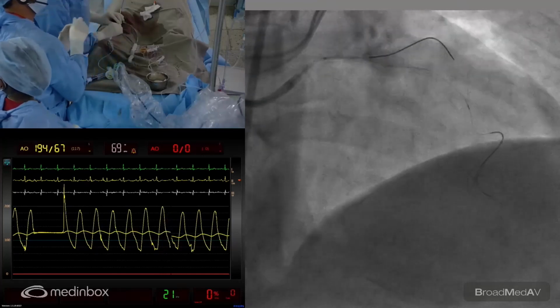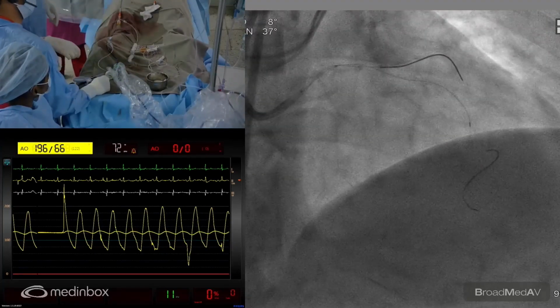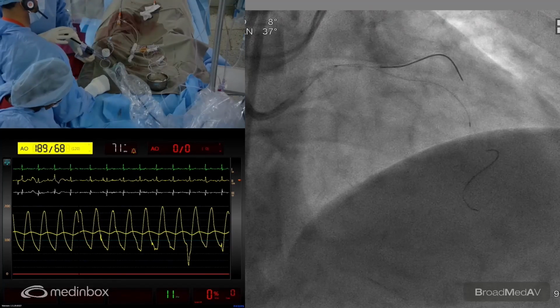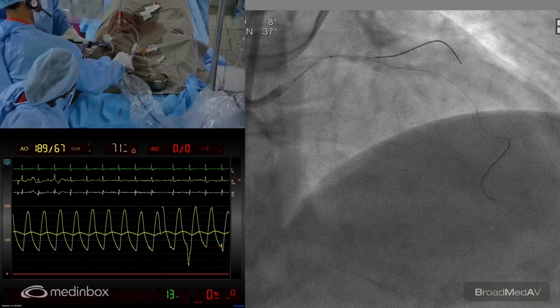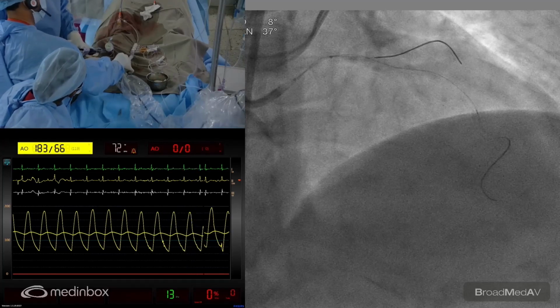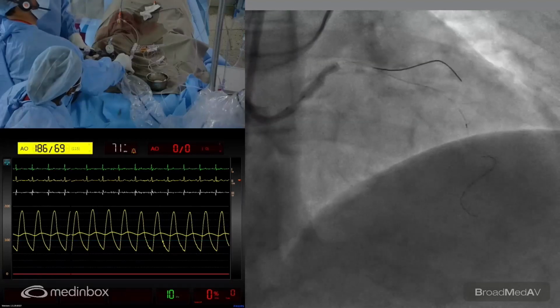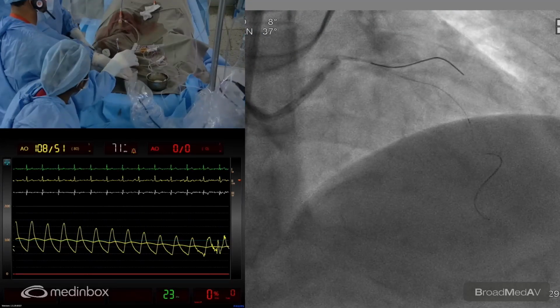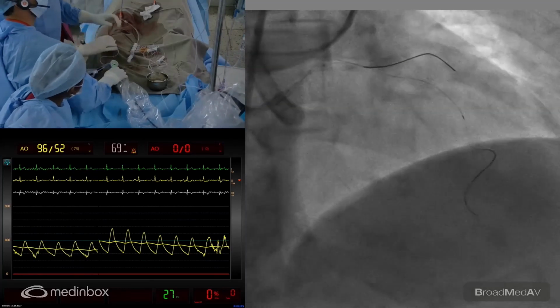I'll reduce the pressure on the catheter. We're releasing the guide. And now I will go up with the balloon at 4 atmospheres. And then, Ram, when I tell you, we can start the pulses. So let me just first go up with the balloon. Sir, can you deflate for some time, sir? Yeah, so the push button has to be pressed on the side.